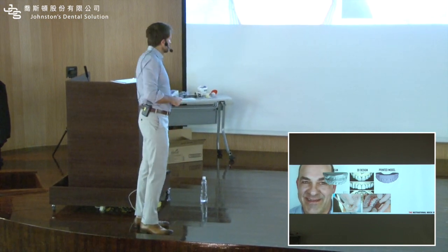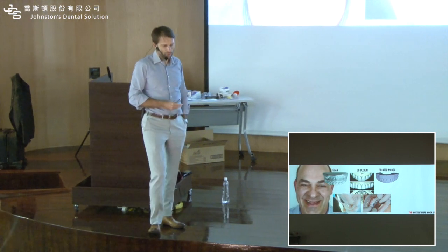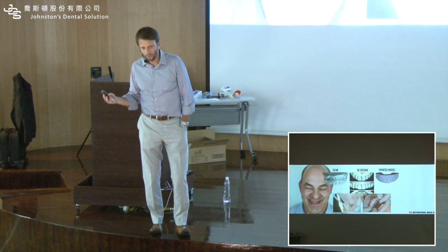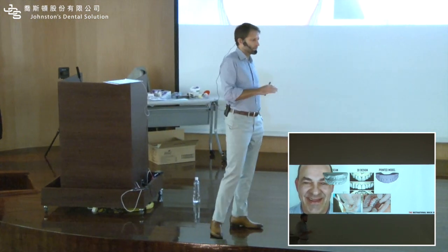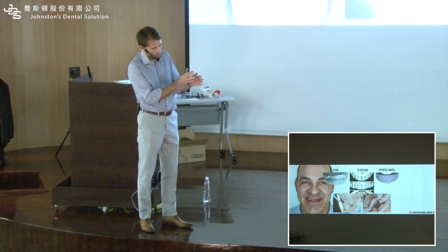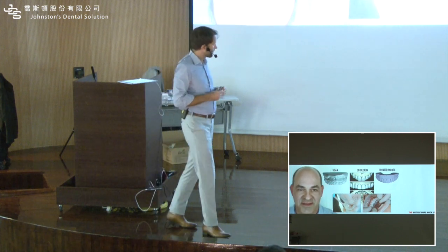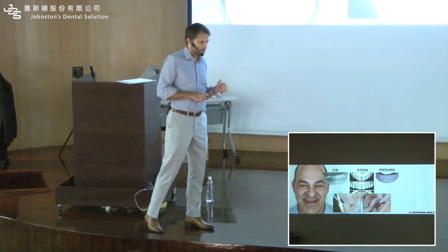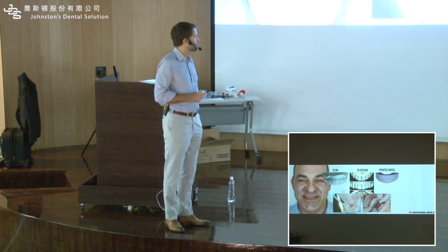So then they may ask, but why you want to place this in my mouth? I don't want to do anything with my smile. Let's say the patient is like, no, I'm not interested. I said, no worries. It's part of the project. We will take care of what you want. But this is simple. It goes in and out. It takes less than 3 minutes. And you're going to be able to see the project. And then we talk later.